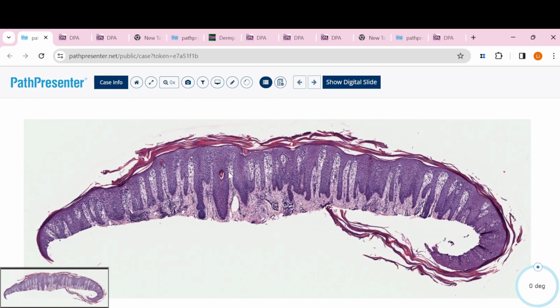Another clinical problem is that if the dermatologist, or even the family doctor, thinks about psoriasis, they usually do not biopsy that lesion. So in the clinic we usually do not see really classic psoriasis, but in the textbook I think this is classic psoriasis. So to make the diagnosis of psoriasis, you need several features.